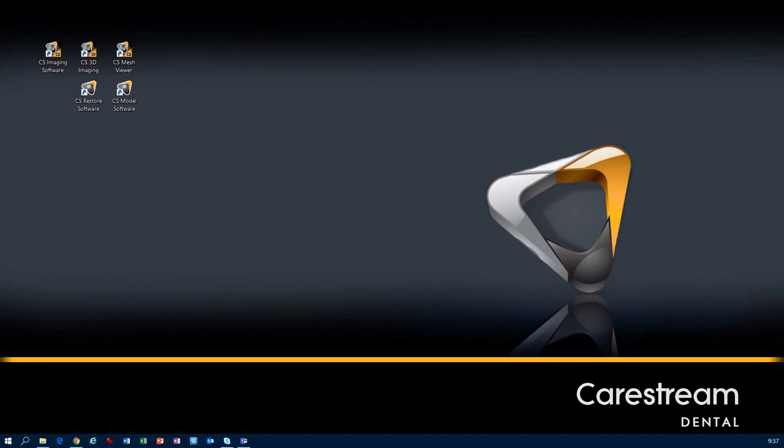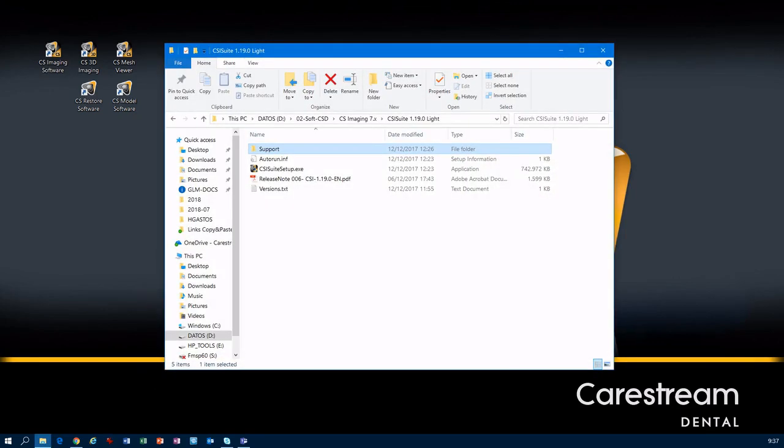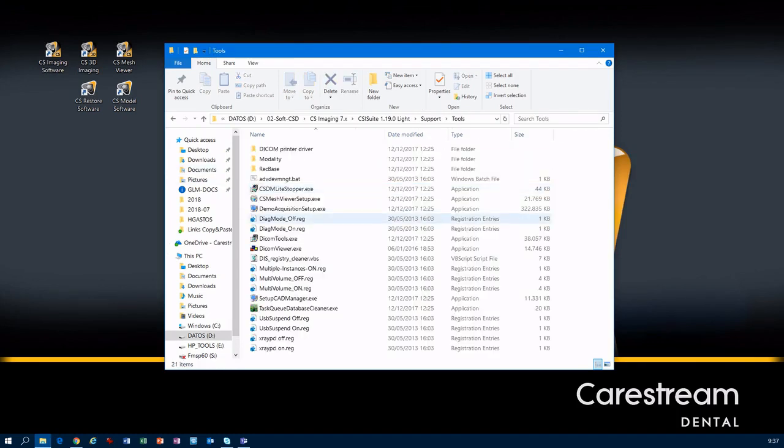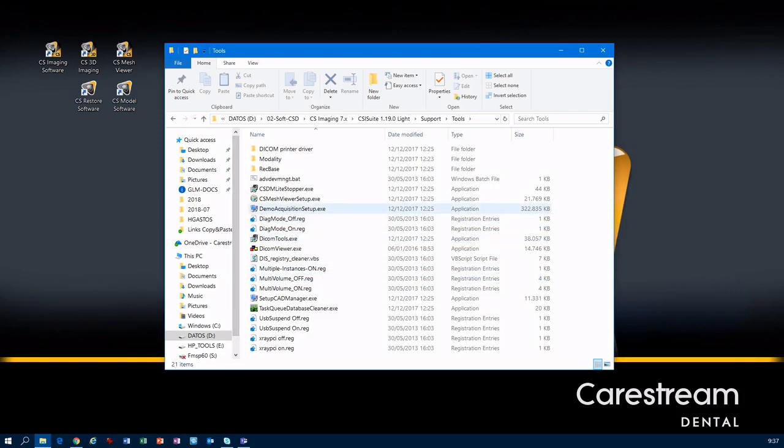To be successful, we have to access an old version of CS Imaging 7 DVD or installer. Open the folder, go to Support, go to Tools, and here we have the demo acquisition setup.